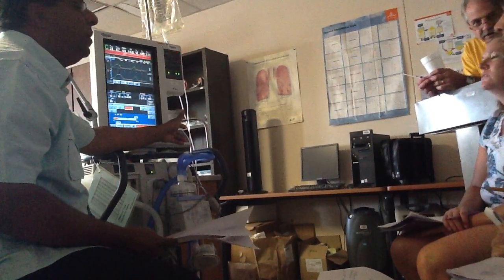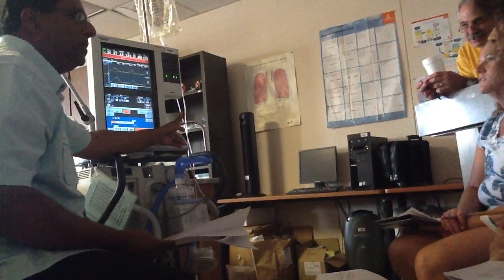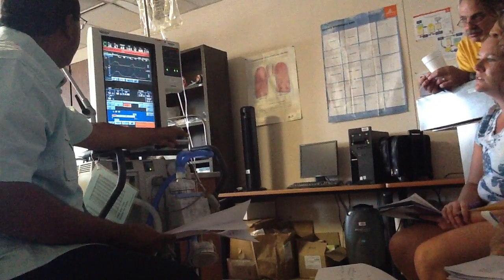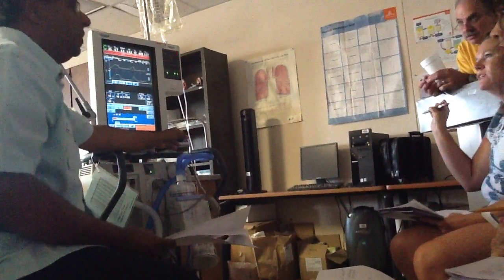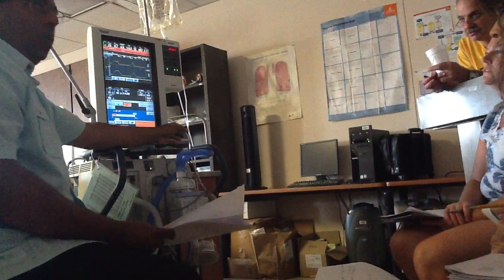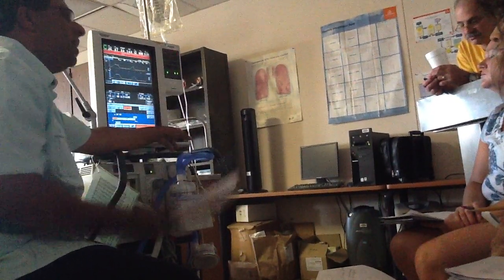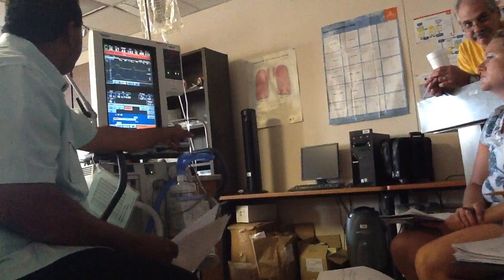Lock it. But if you want a 1 to 1, what would you do? You have to unlock it. Decrease or increase? No, you have to increase the TI. You are going to inverse the ratio, so you want to increase your TI. See the bottom? I'm increasing the TI. This is what I'm talking about, the concept. Look at the bottom, you're increasing the TI.